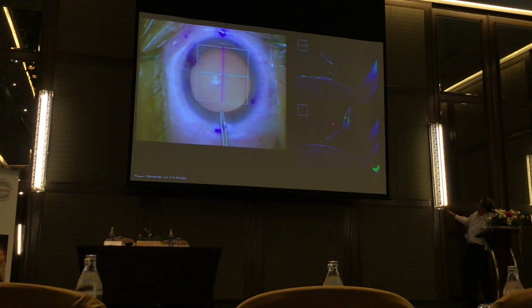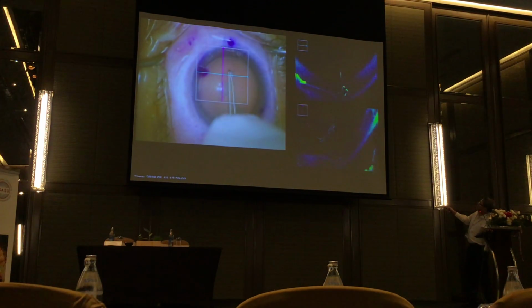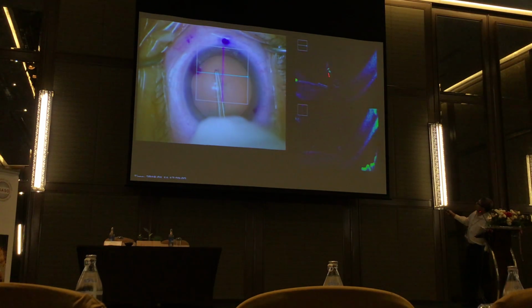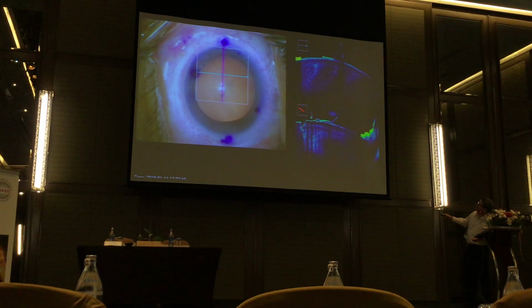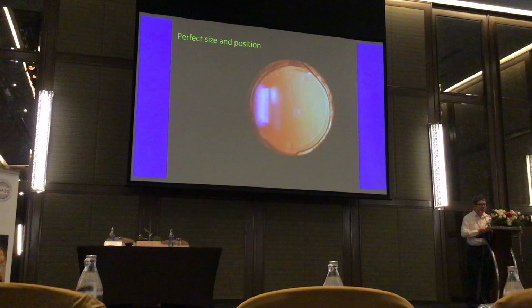But from this, you can see that if your flap is standing very, very high up, which we'll see again in a minute, and you hold it at the top of the flap, you're just going to run out of room. If you're holding the flap up there, you don't have room left to pull. So I would always recommend you hold somewhere down here, nearer to the point of tear. That just gives you enough room and leverage. Very simple, basic point, but worth thinking about.